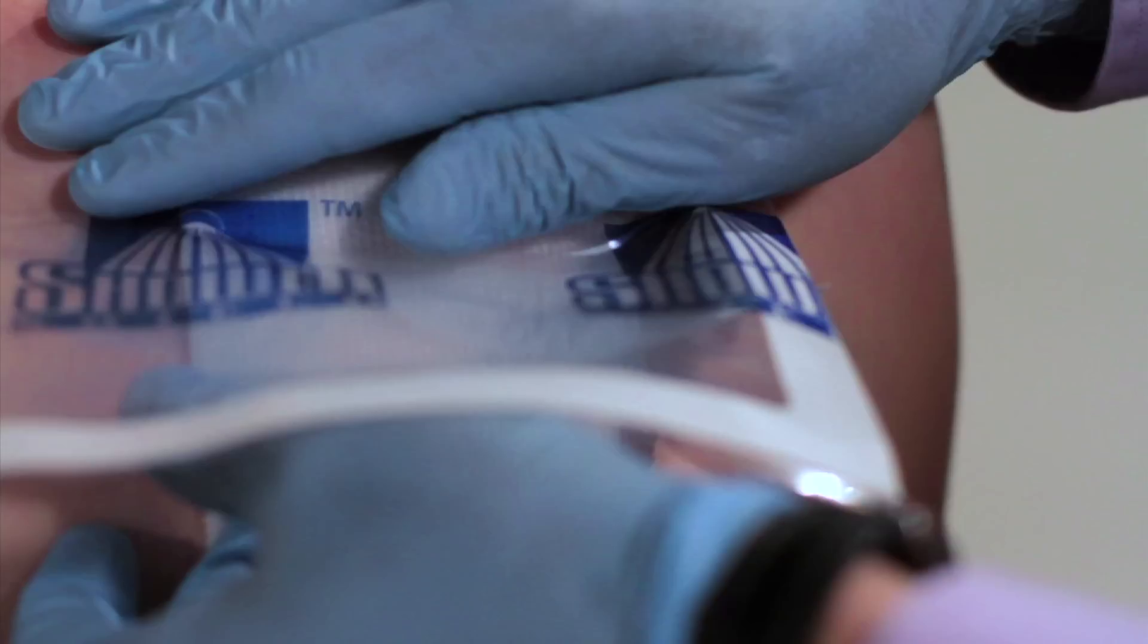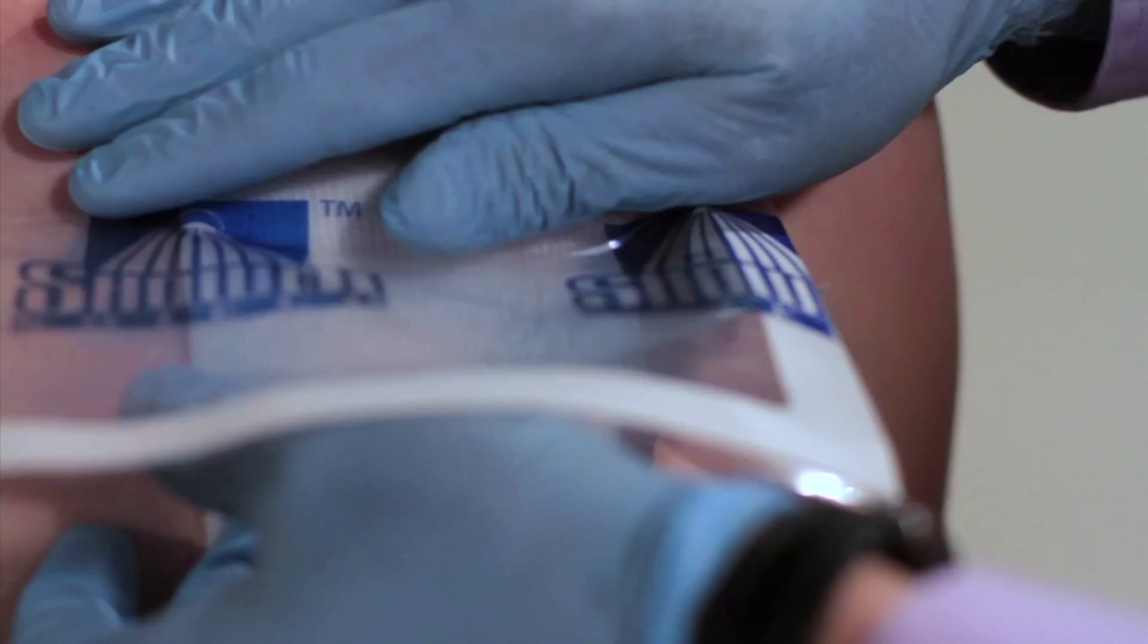Next continue to peel the backing down, down the sides, sticking as you go. And lastly, you do the bottom and you just do the best that you can.